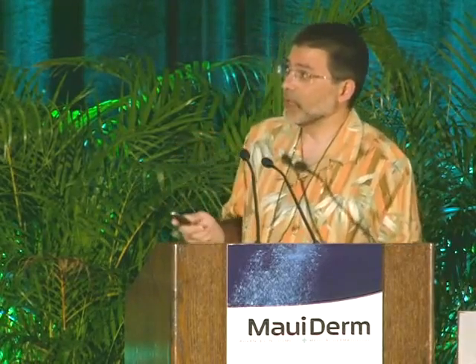So with polarized light, your specificity is not as good. You tend to remove more seborrheic keratoses than you would with standard dermoscopy, and that's because the milia cyst, which is a very important clue, is missing with polarized light. And to make that point a little bit stronger, we're going to show you a video in a second.